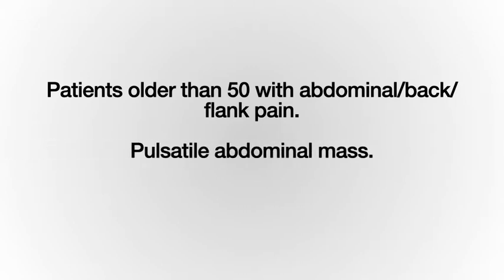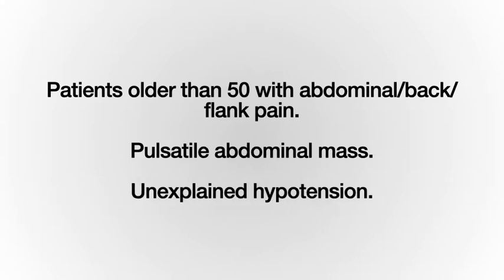Obviously, if the patient has a pulsatile abdominal mass, you should evaluate their aorta. Lastly, any patient with unexplained hypotension or older patients with dizziness or syncope should have a bedside aortic ultrasound.